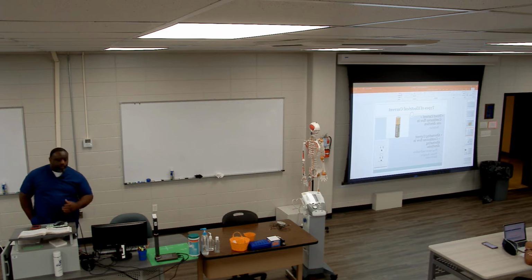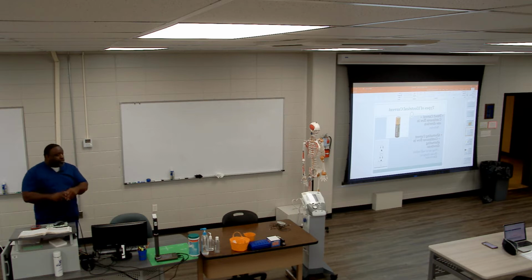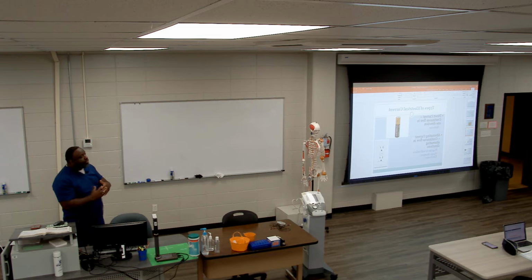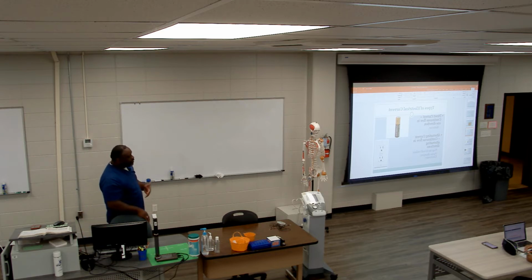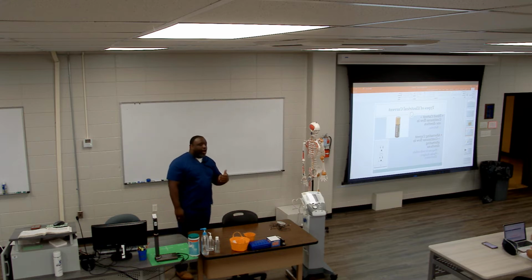Okay, so as it relates to electricity in general, we have multiple types of electricity. Things are supplied with power one of two ways, primarily. It's either going to be alternating current or direct current.